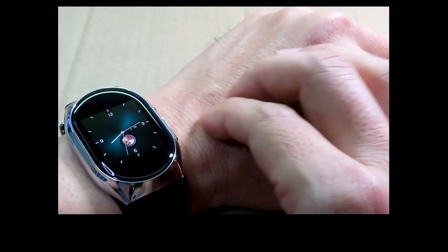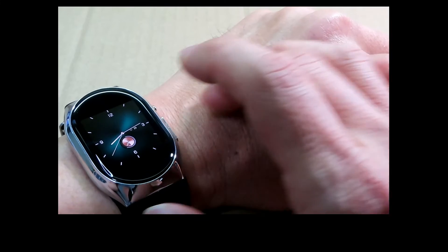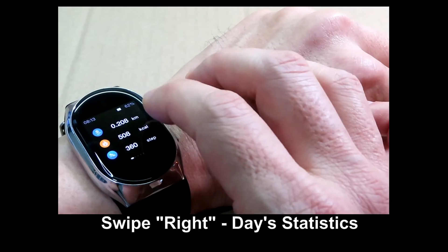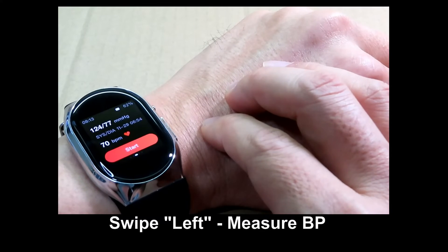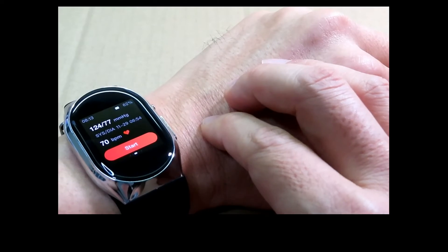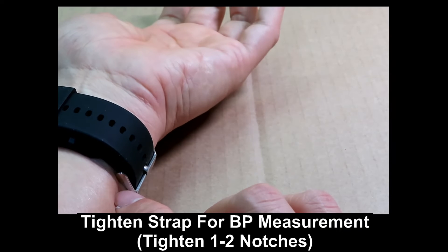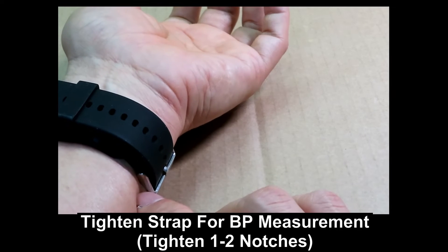Going back to home, this is pretty much the application for this watch. Swipe to the right to see the day's statistics, and swipe to the left to go straight into BP measurement. For BP measurement, you actually need to tighten the strap, otherwise you won't be able to do a proper measurement.